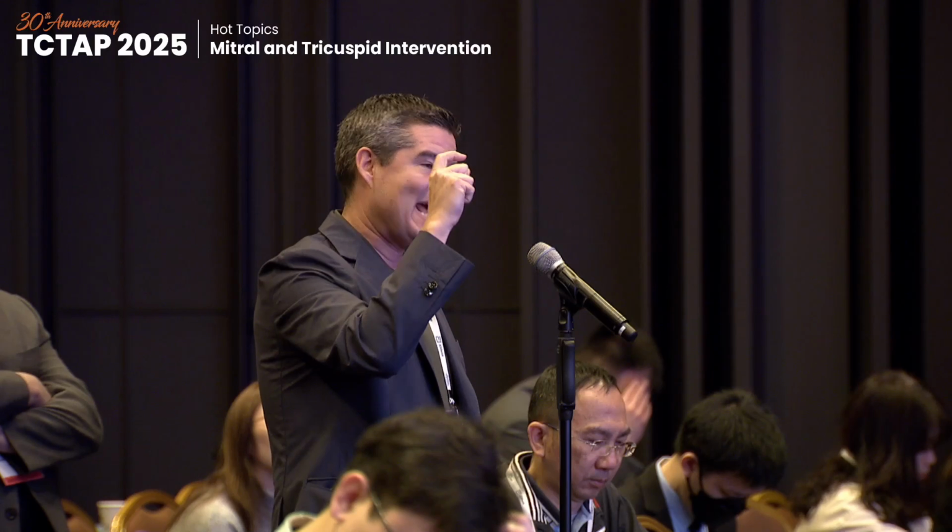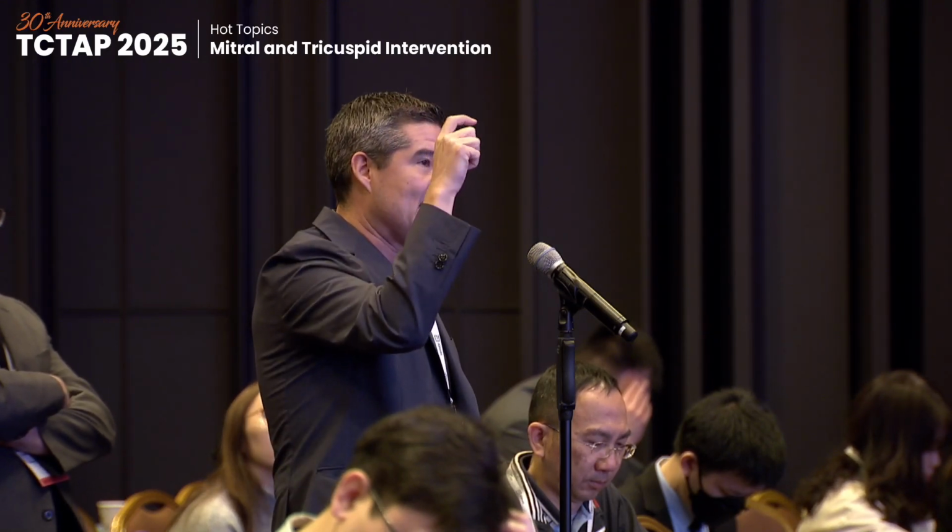Low-profile valves, such as Cephea with Abbott, land very high, but if you don't capture the anterior leaflet, then the anterior leaflet is going to have a parachute effect, and this is where LAMPOON may be important. I honestly don't think that any valve is going to be able to overcome 100% the LVOT obstruction.